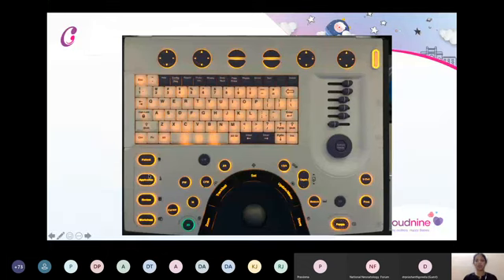You need to choose which you're going to perform because it may show up as echo, it may show up as cardiac, it may show up as cranial. So neo head means that you're going to perform the cranial ultrasound. So you choose that. And then the review is to look at the images that you have already stored. Then once you have started doing the ultrasound, if you want the image to be stored, you first freeze over here and then save.